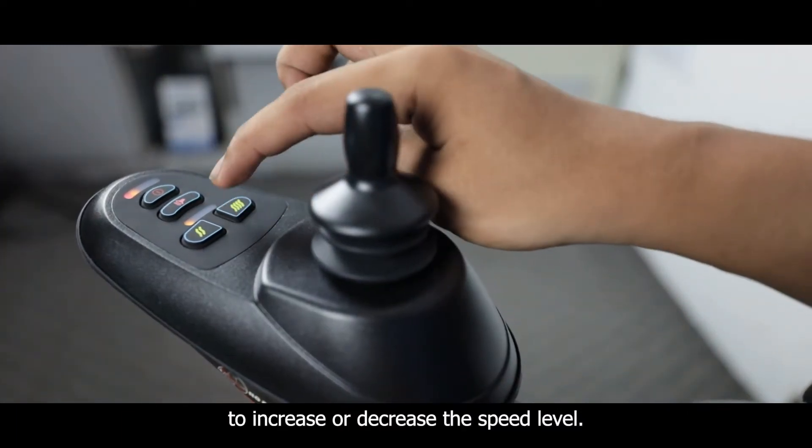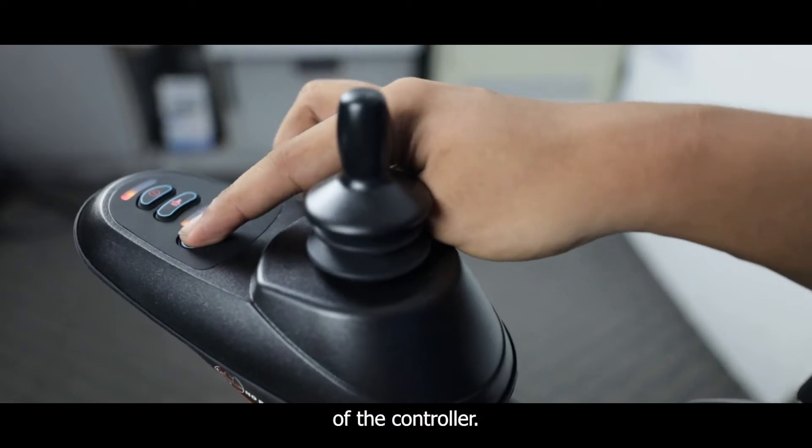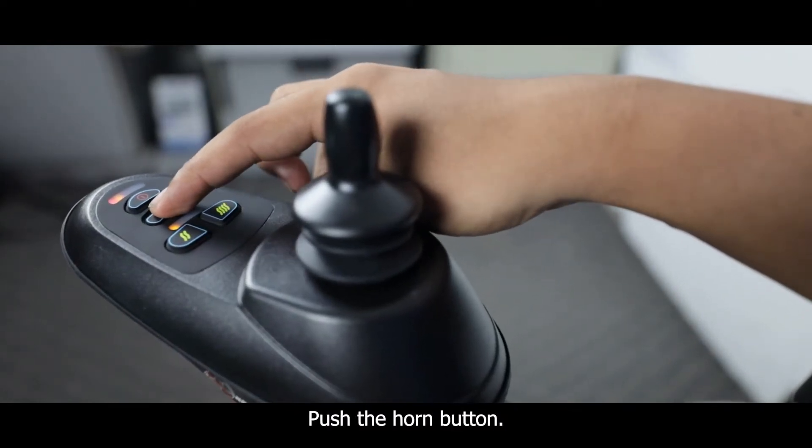To increase or decrease the speed level, use the buttons on the bottom of the controller. To beep the horn, push the horn button.